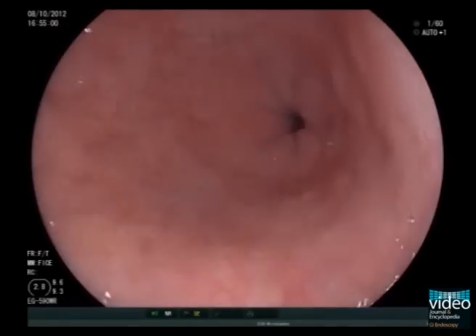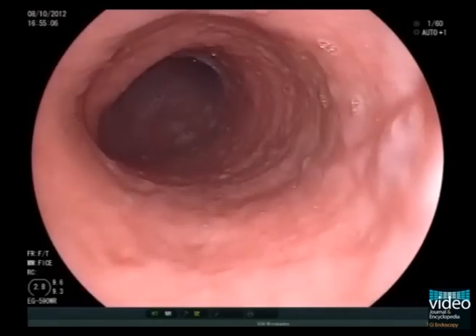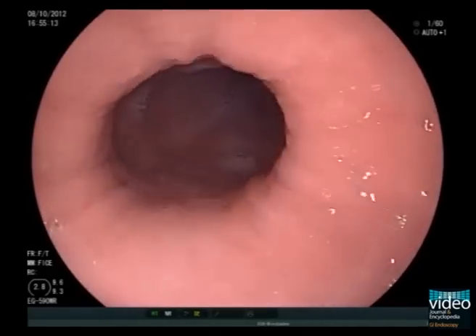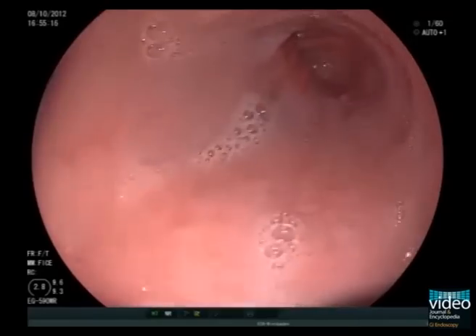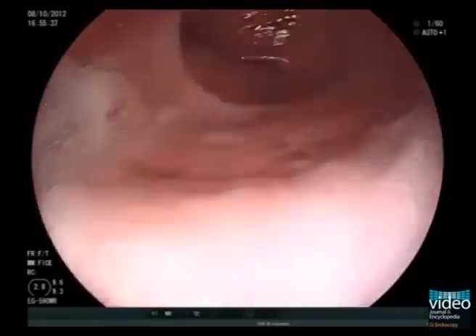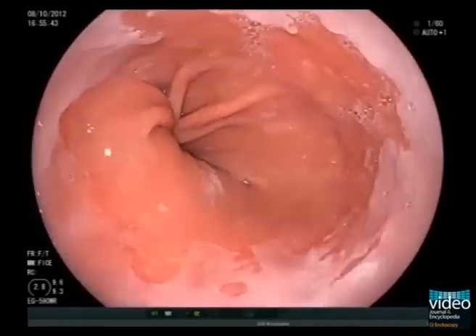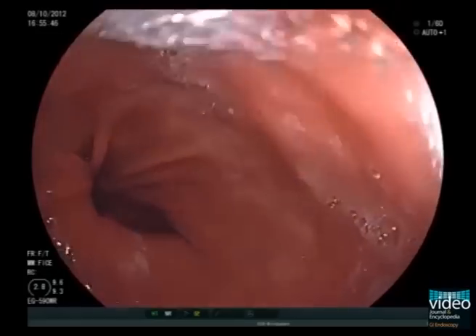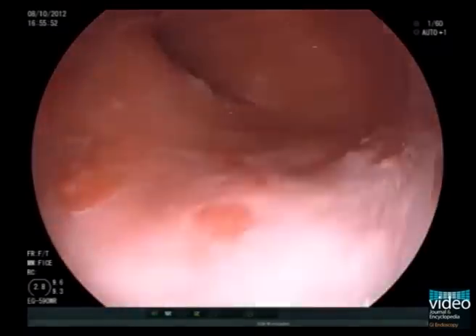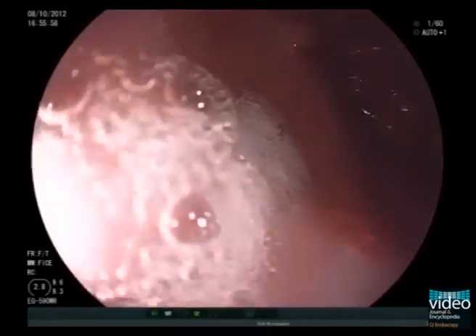Advance the endoscope slowly to allow careful examination of the esophageal contour and mucosa. Examination of the esophagus ends with inspection of the gastroesophageal junction, with its level being determined in relation to the diaphragmatic hiatus. The red mucosal tongues at the gastroesophageal junction are highly suggestive of short Barrett's esophagus.